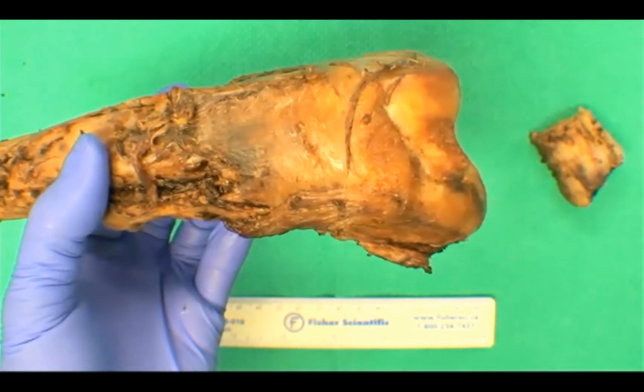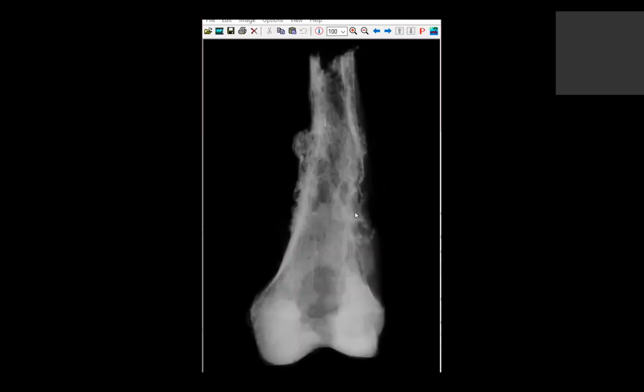Likewise, I want to share screen here again. So this is the X-ray of this specimen, and again, you can see some of these different changes related to what we're seeing on the specimen. To answer the question previously, do we have a Faxitron? Fortunately, we do. We have a Faxitron in our autopsy suite, and it's been a lifesaver in terms of getting radiographic images for a lot of our specimens, both our bony specimens, some of the composite resections we've seen in previous weeks, but it's also heavily used in our perinatal service as well.